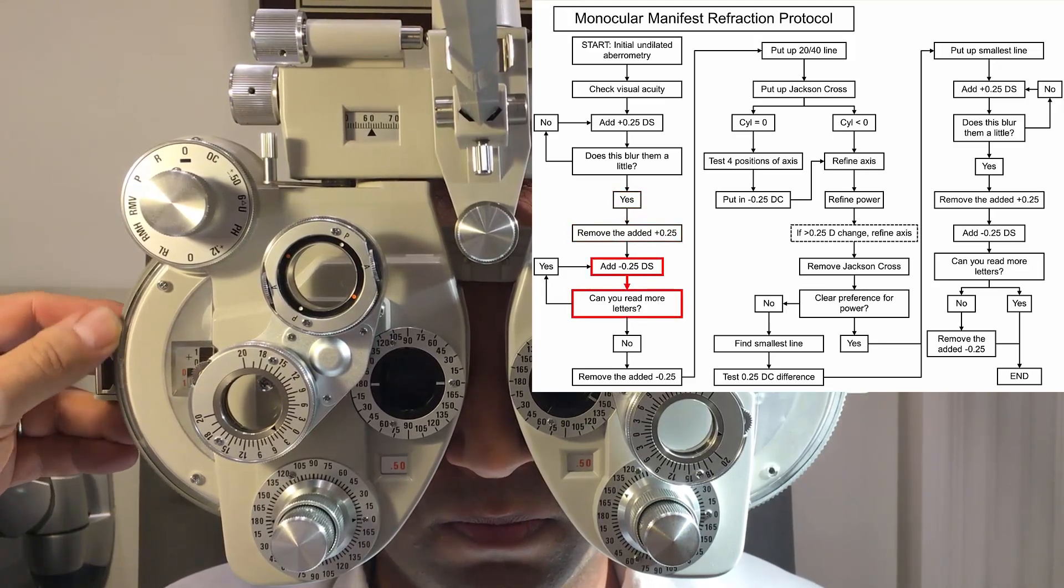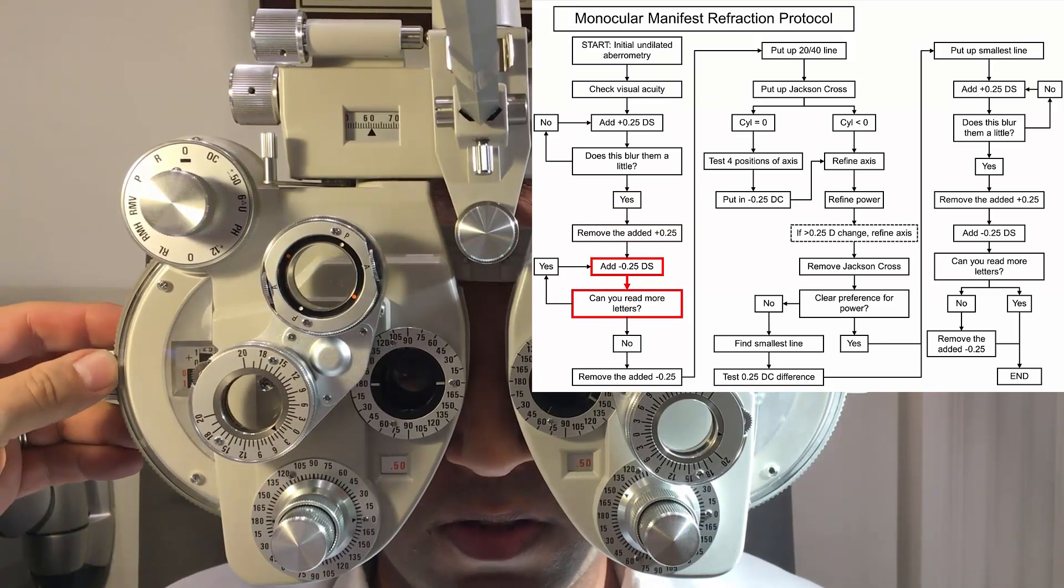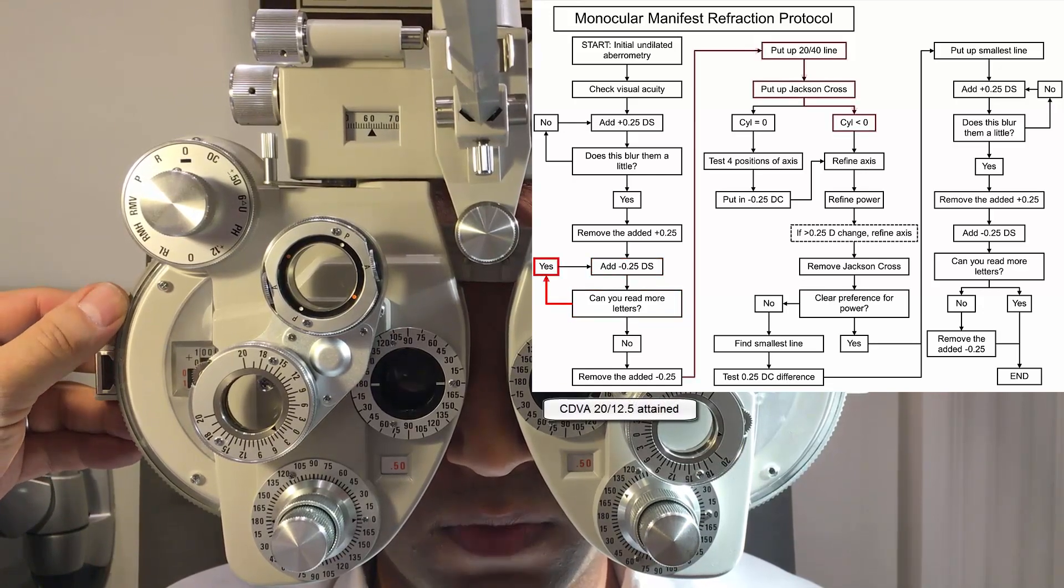Any more if I go to there, or about the same? No, that's better. So even sharper here? Yes.